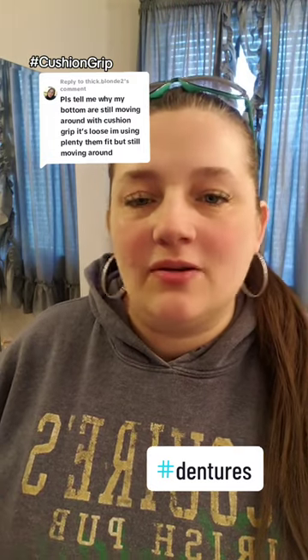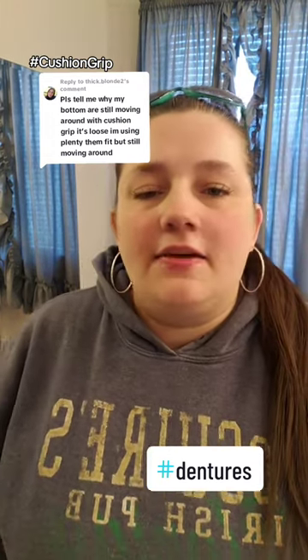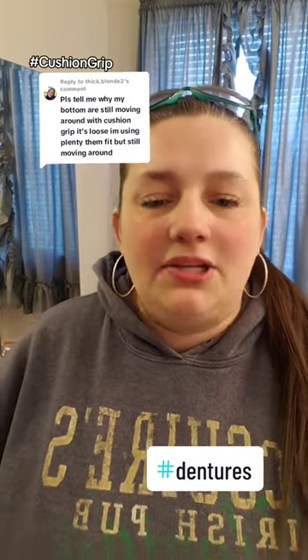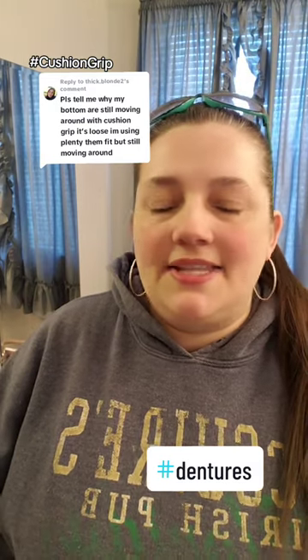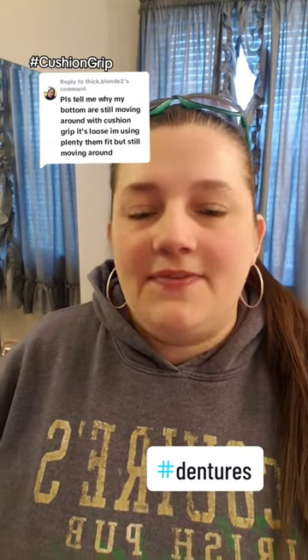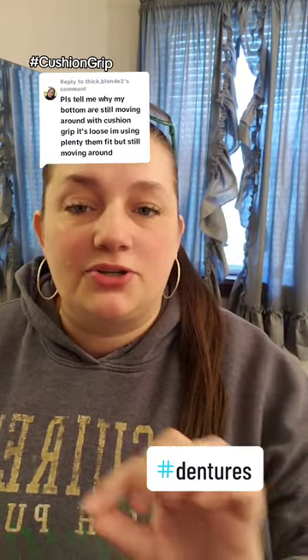If you find that your lower denture is still moving around after applying Cushion Grip, here's what you can do — there's two things. The first thing is you can apply a little bit more. I do about two-thirds of the way full and allow some overflow. And instead of trimming that overflow, if it's not bothersome or visible, just leave it, because it's going to help create a suction seal around your denture.